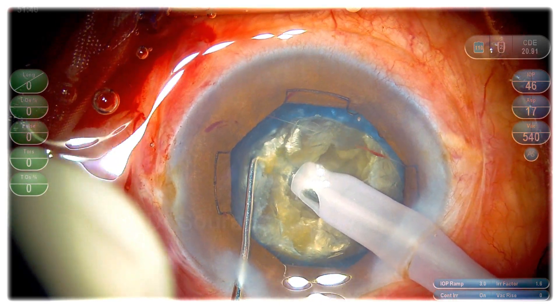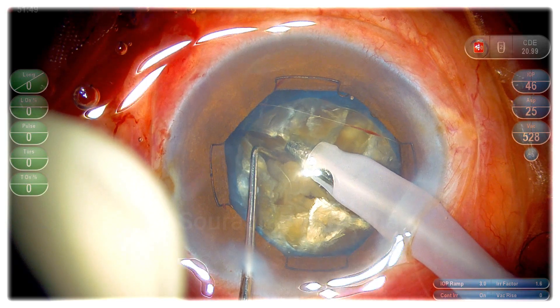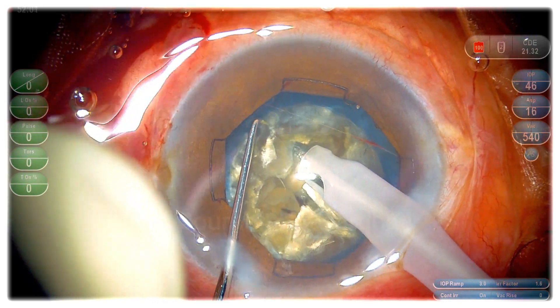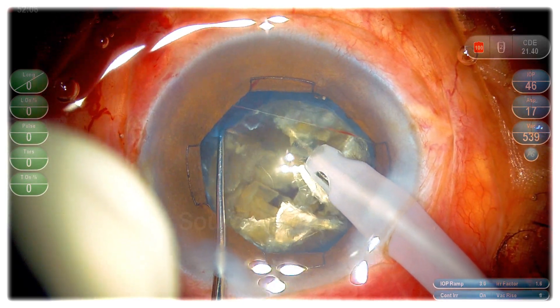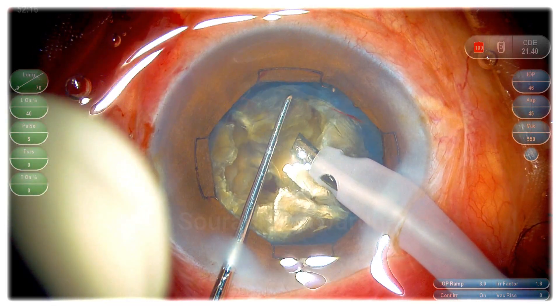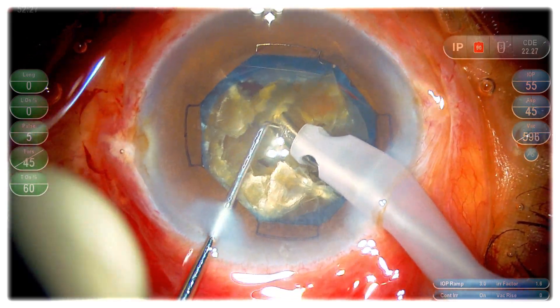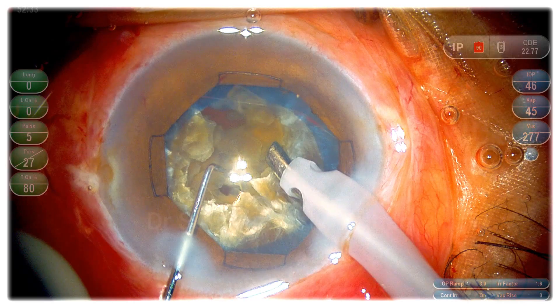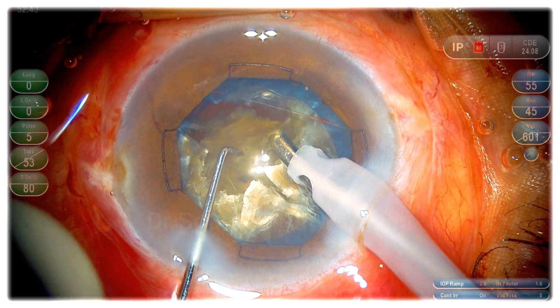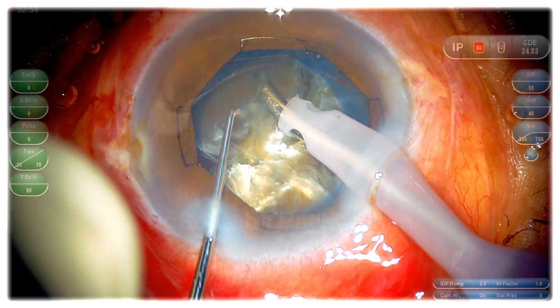Going to quadrant removal: I have raised the IOP to 55, flow rate to 45, and vacuum to 700. I have started emulsifying using only torsional phaco with IP on — torsional phaco at 70% and 80% on-time with 5 pulses per second. This is my standard parameter for this grade of cataract. I keep everything on linear so that I can control the energy delivered.